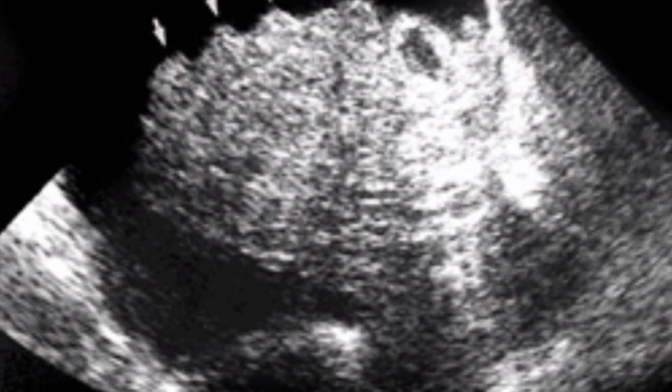In this image, you are looking at surface nodularity. Transverse and sagittal views of the liver surrounded by ascites show nodularity of the anterior surface of the liver. Then in this image, marked surface nodularity. The transverse view here shows marked nodularity. You can see the white arrows show the anterior surface of the liver surrounded by ascites, and a small shrunken liver.